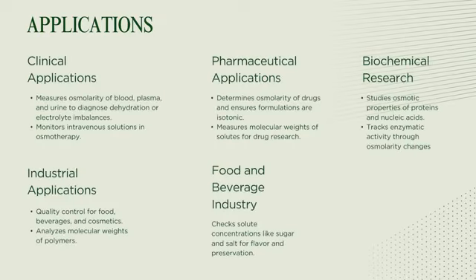Now, these are its applications. It is used in the measurement of osmolarity in biological fluids such as blood plasma, serum, and urine. It helps in diagnosing and monitoring conditions such as dehydration, hyponatremia, and hypernatremia, and other electrolyte imbalances.